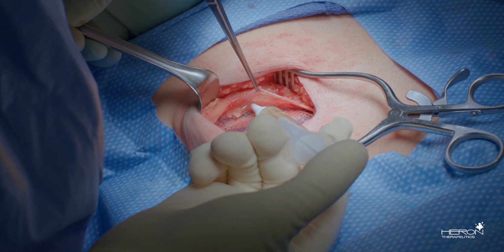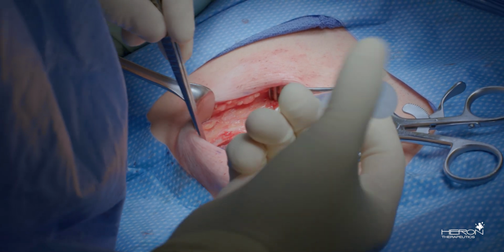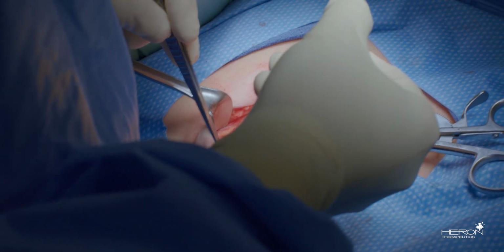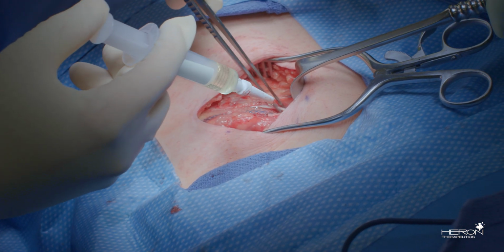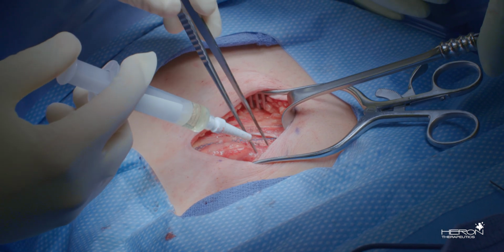Apply about 2/3 of the product on top of the mesh. Place the product laterally along the ilioinguinal and iliohypogastric nerves, medially along the pubis and obturator nerve, and along the cord structures and genitofemoral nerve.